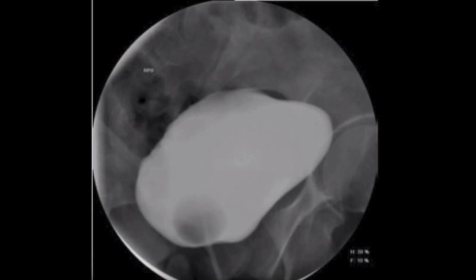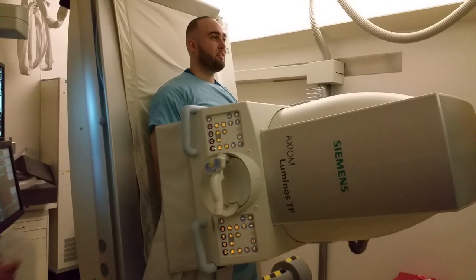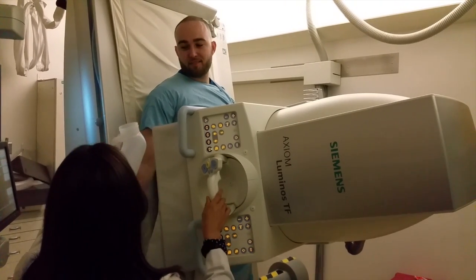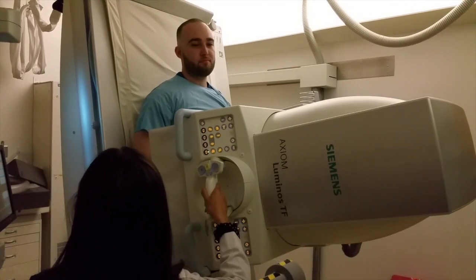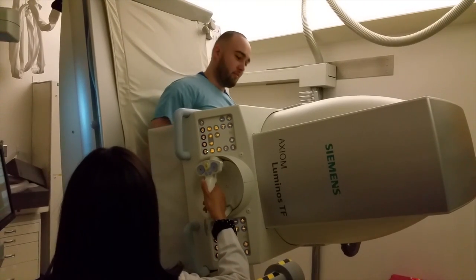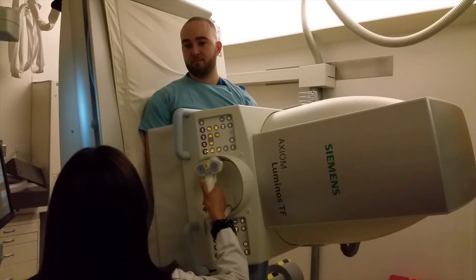In the RPO position, image the left ureterovesical junction, and if vesicoureteral reflux is seen, image the left ureter and kidney.